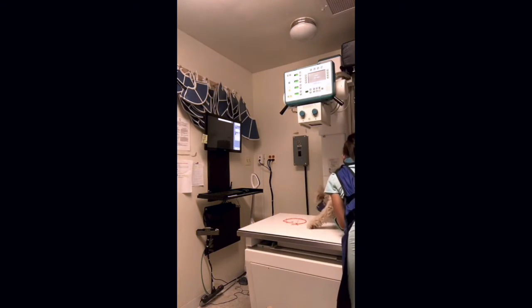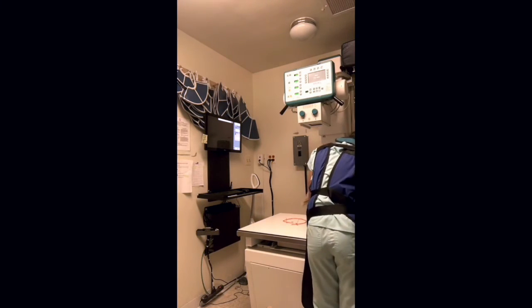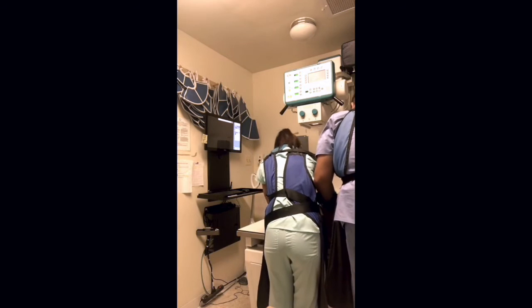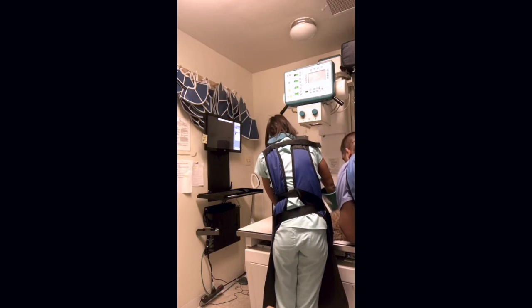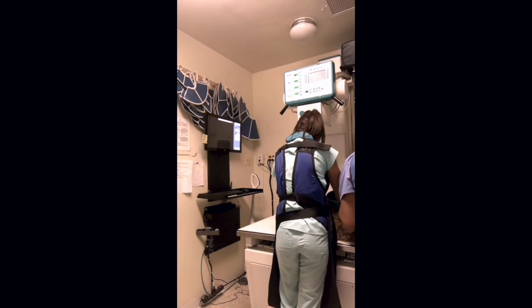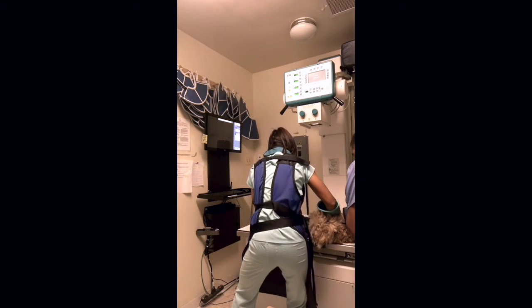I should also mention that a lot of patients for extremity radiographs have to be sedated because it's so painful for them to be in certain positions that we need to obtain certain extremity radiographs. I was really lucky with this patient, Charlie, because she was super well behaved and she didn't need any sedation. And now that we finally got all of our computer technical difficulties squared away, we are ready to take more radiographic extremity views.